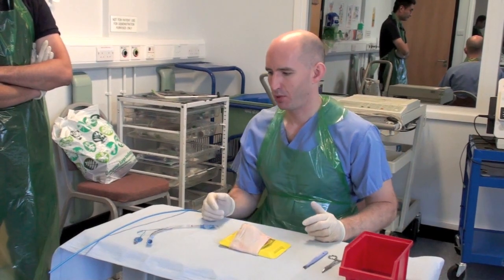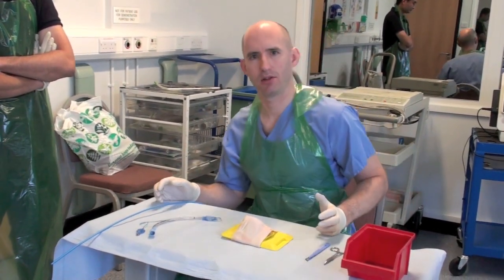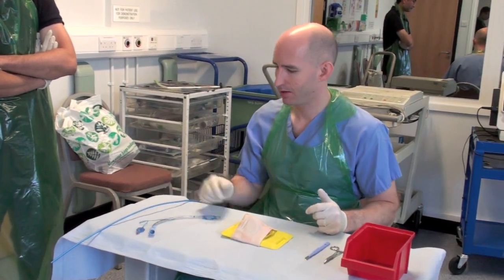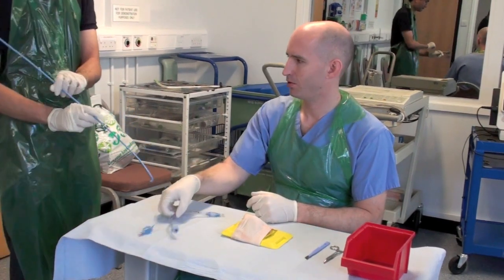Essentially your assistant is going to be acting in a capacity to hand you things, so you don't actually have to look away from the specimen or the patient as you're doing it. I'm going to hand this bougie and the tube to Aishi.